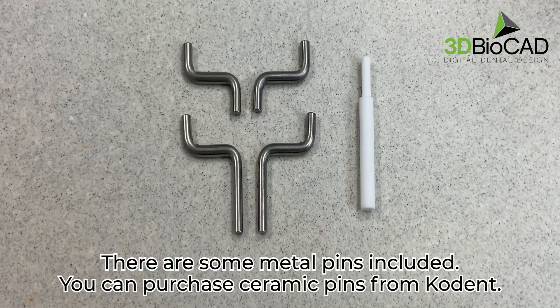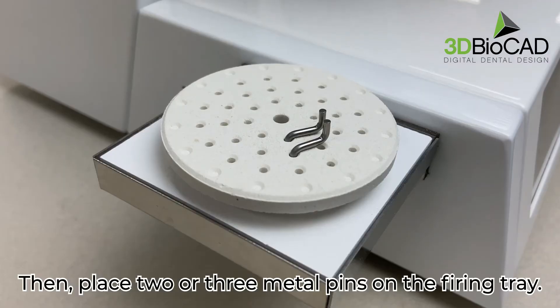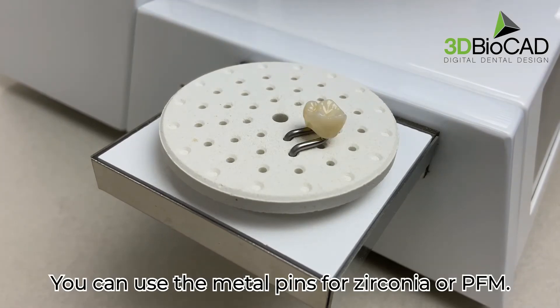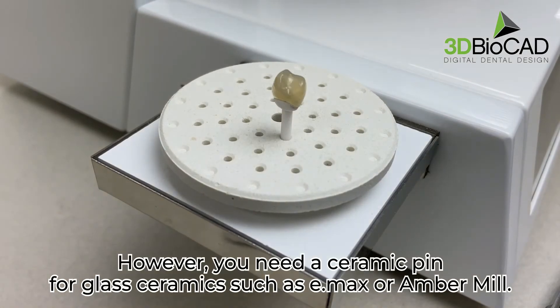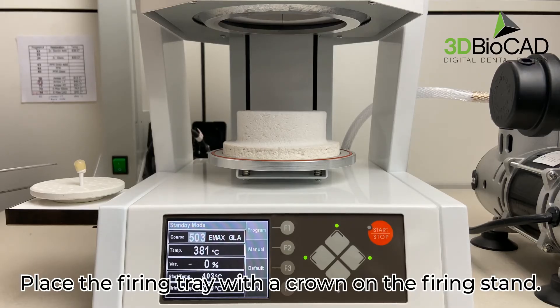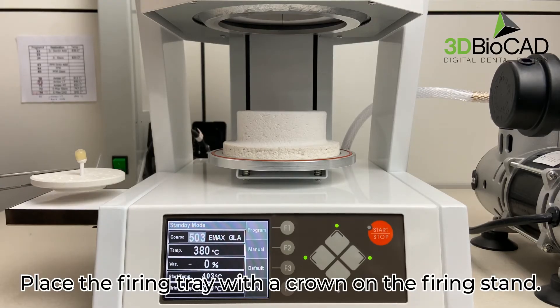There are some metal pins included. You can purchase ceramic pins from Code End. Place two or three metal pins on the firing tray. You can use the metal pins for zirconia or PFM. However, you need a ceramic pin for glass ceramics such as Emacs or Amber Mill. Place the firing tray with a crown on the firing stand.